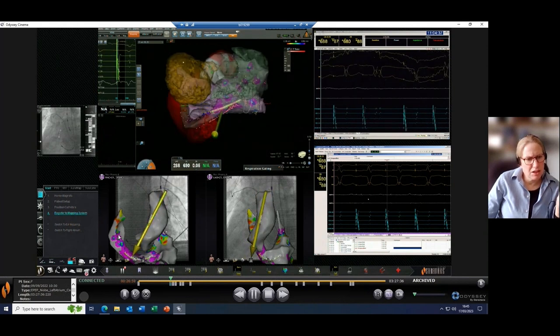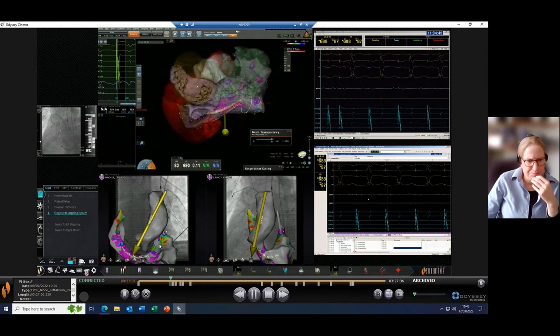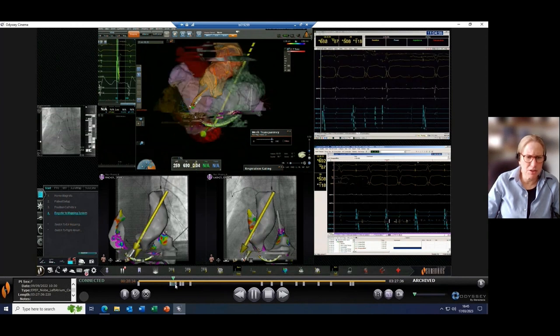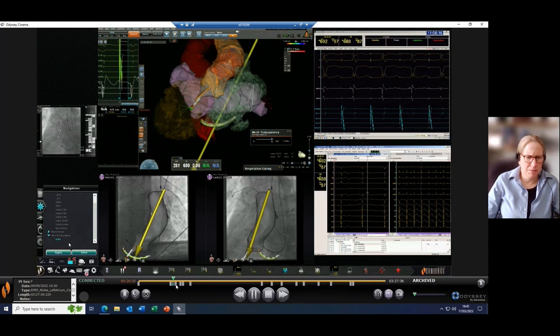And you can see here the left persistent SVC. Of course, it's situs inversus, so here is the big ridge basically on the epicardium. But see, that's equal to a vein of Marshall. Okay, so here you can already see we're in the aortic root. I jump a little bit forward. It's very easy to cross the aortic valve.